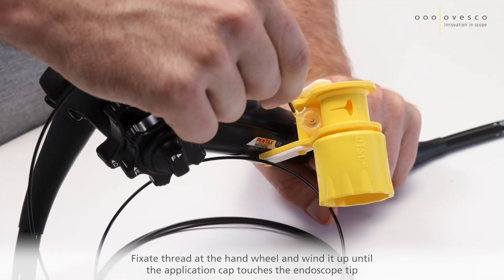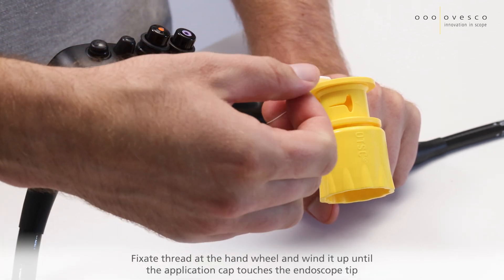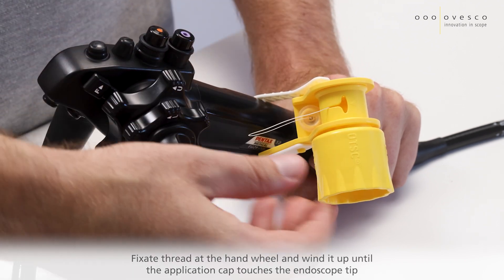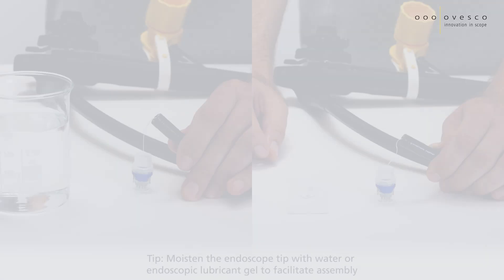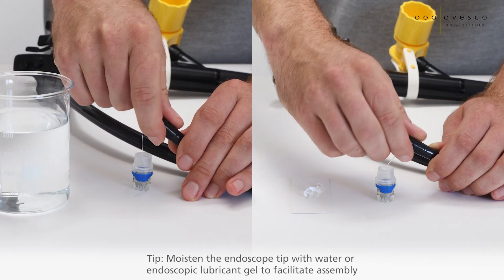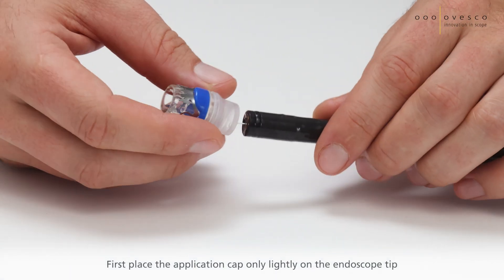Fixate the thread at the handwheel and wind it up until the application cap touches the endoscope tip. Tip: Moisten the endoscope tip with water or endoscopic lubricant gel to facilitate the assembly. First, place the application cap only lightly on the endoscope tip.